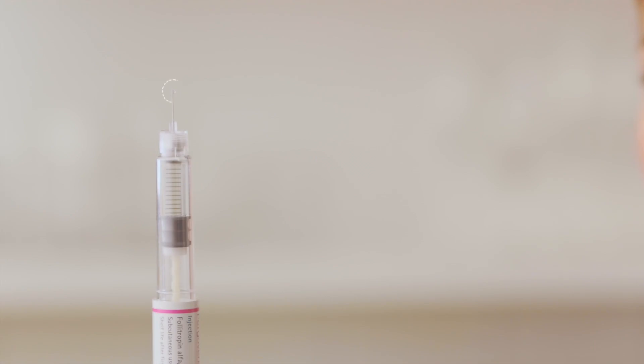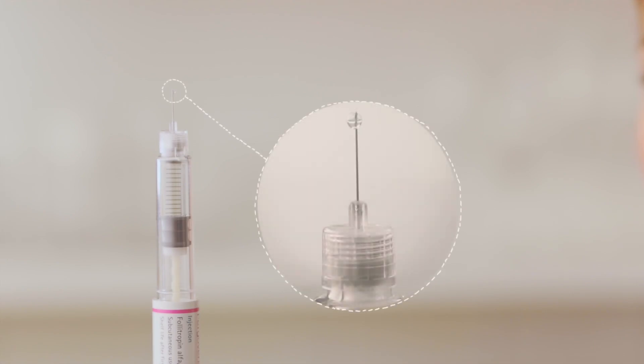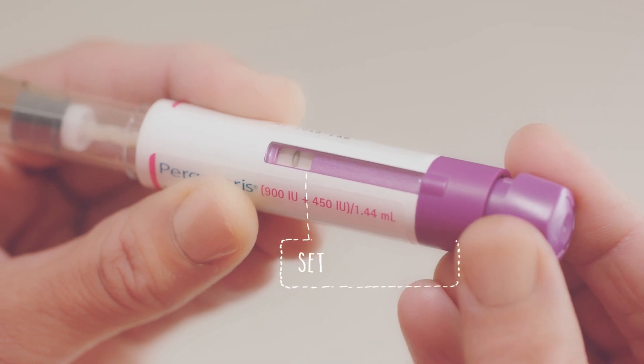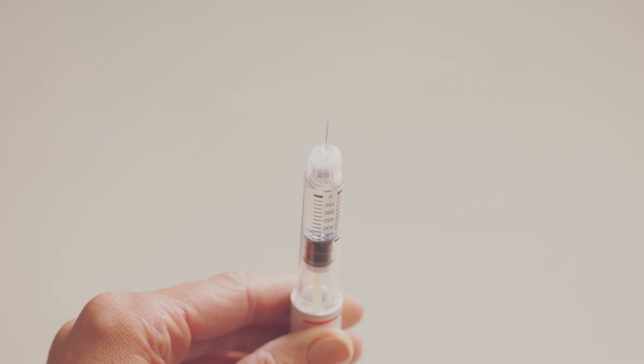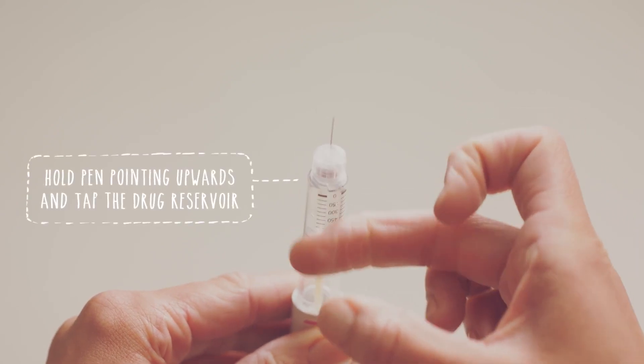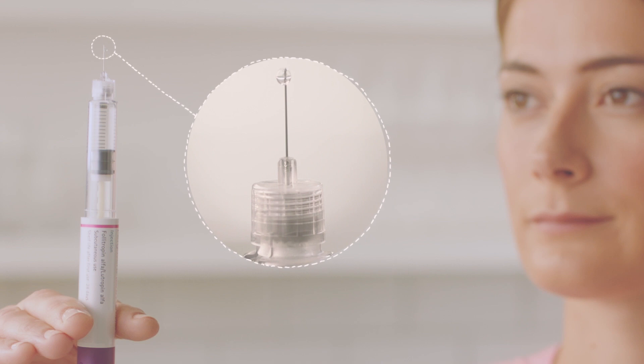To do this, look carefully at the tip of the needle for a tiny drop of fluid. If you can see one, then your pen is ready and you can skip straight to setting the dose. If you don't see a drop of fluid, here's what to do. Gently turn the dose setting knob clockwise until it reads 25 in the dose feedback window. Then, holding the pen with the needle pointing upwards, gently tap on the drug reservoir. While still keeping the pen upright, push the dose setting knob in fully until the dial returns to zero. You should be able to see a small drop of liquid at the tip of the needle, which means you've removed all the air. If you still can't see a drop of fluid, repeat these steps until you can. Don't worry — there's always a bit of extra fluid in the pen, so you will have enough for your dose.